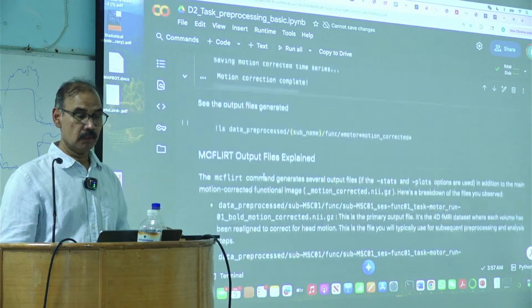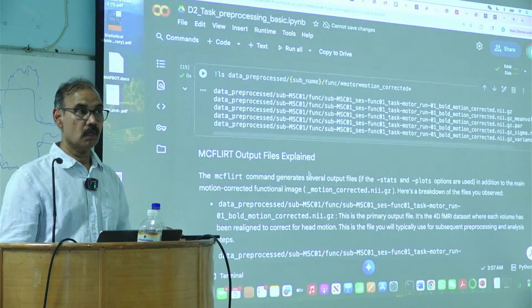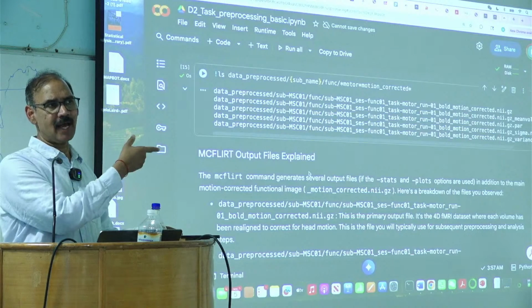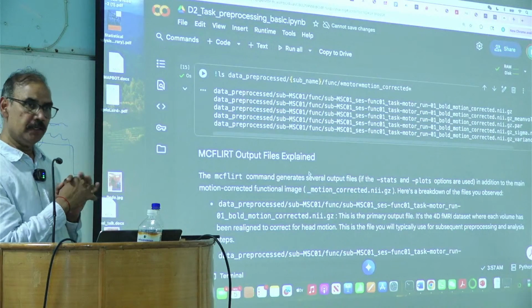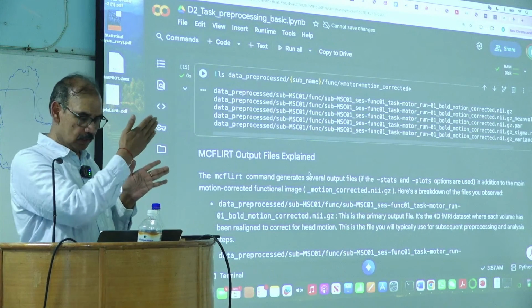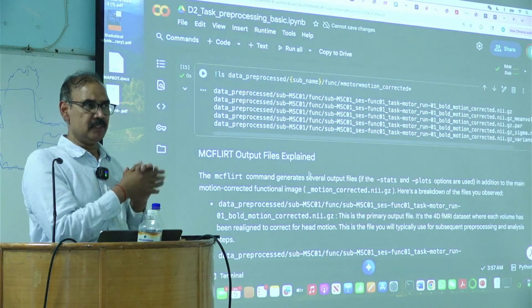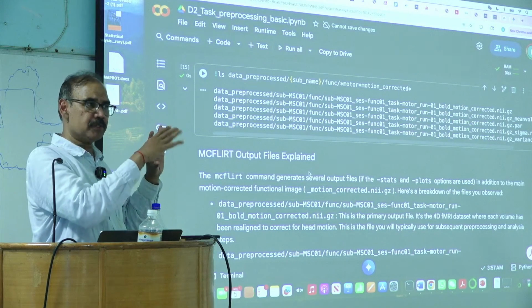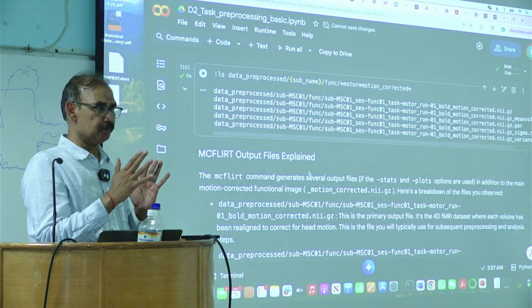Yeah. No, you can, but you cannot use the parameters I have used here, right? Because in DTI, maybe the analogy is there is an object and you have taken pictures while the object has moved, but everything else has remained the same, right?